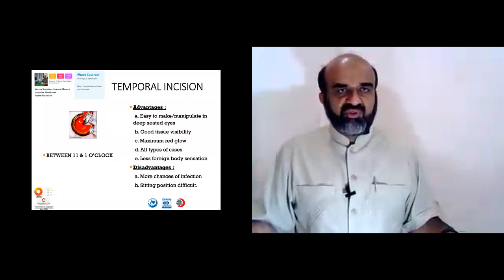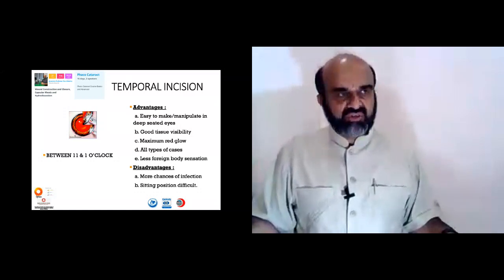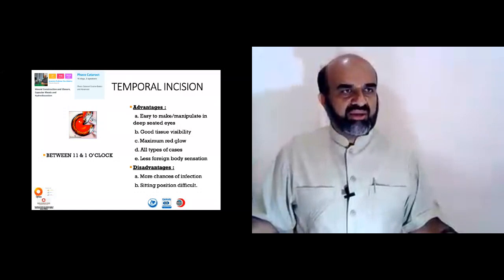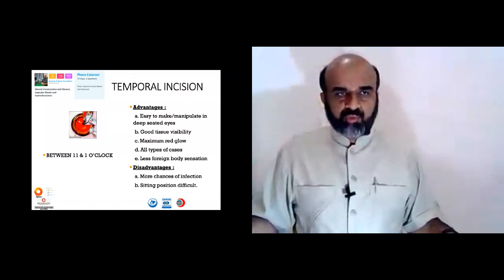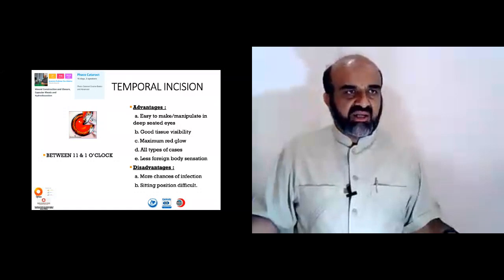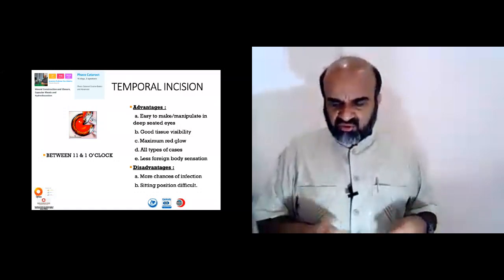Two, you have to change positions. As we discussed in our previous talk, the role of the non-dominant hand in phaco cataract surgery. If we are not very well versed with use of both hands to place incisions and to handle the instruments and phaco probe, then to perform surgery through a temporal approach you will need to rotate your positions. That is generally cumbersome, that you have to sit temporally and leave the head side, which most of us are used to. So this is a kind of relative disadvantage.